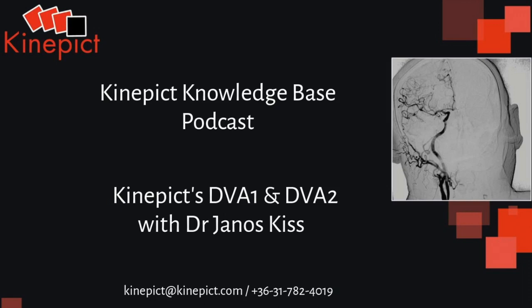And probably we will not include it in all other versions. Of course, it requires some further planning, but I have to mention that if you calculate more images, it takes more time. So in certain areas where the DVA2 image is not beneficial, it makes no sense to dedicate time for the calculation of DVA2. But it depends on the developmental plans.